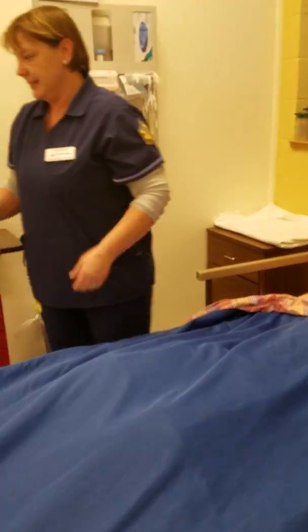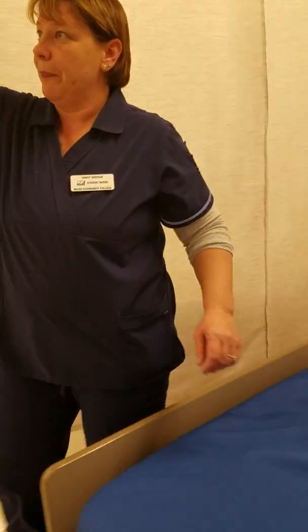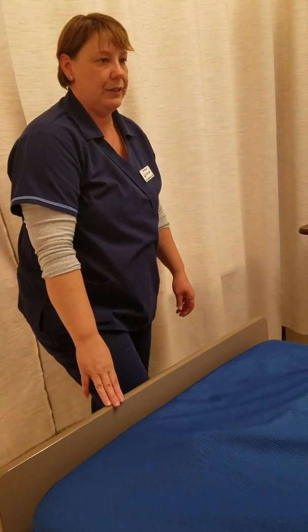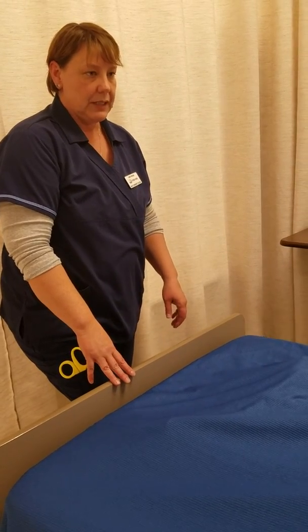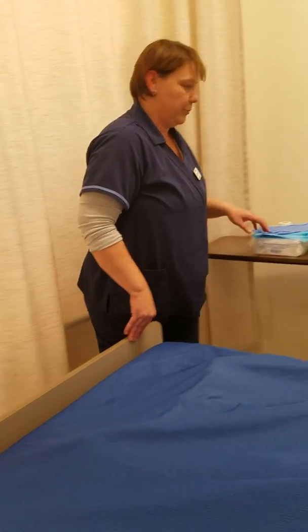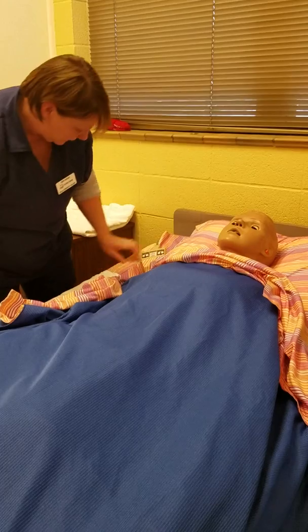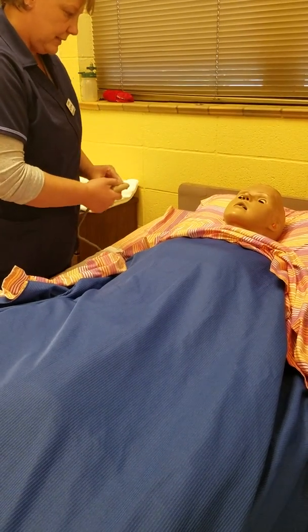I'm going to ask his family to please leave the room. I'm going to pull the curtain for some privacy, and then I'm going to raise the bed up to a nice working height so that I can insert the catheter comfortably while also keeping him fairly comfortable. I'm going to go ahead and lower the bed rail and lay this back.